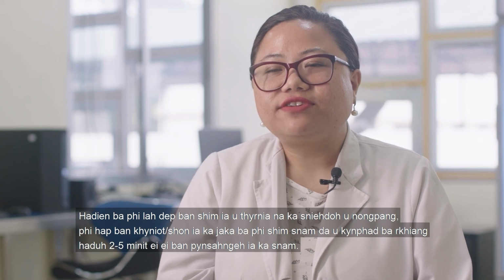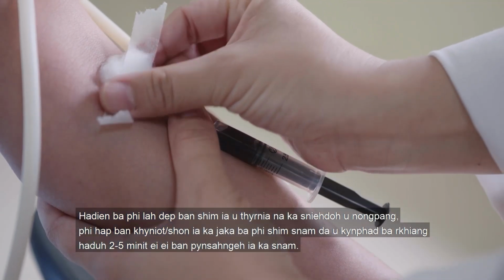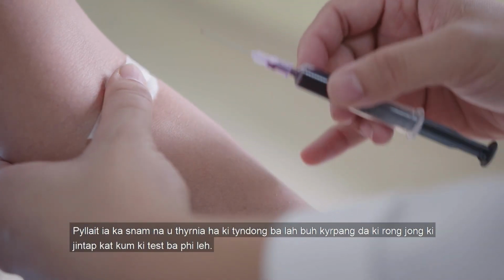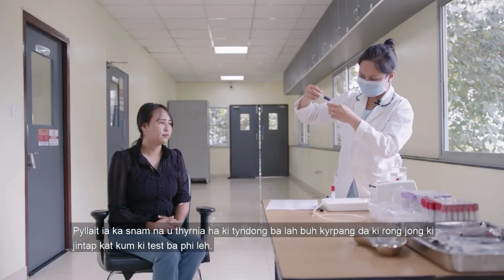After you've taken out the syringe from the skin of your patient, you're going to press that area of puncture with a dry cotton for 2 to 5 minutes in order to stop the bleeding. Transfer the blood from the syringe to the required colored cap vials depending on what test is being done.